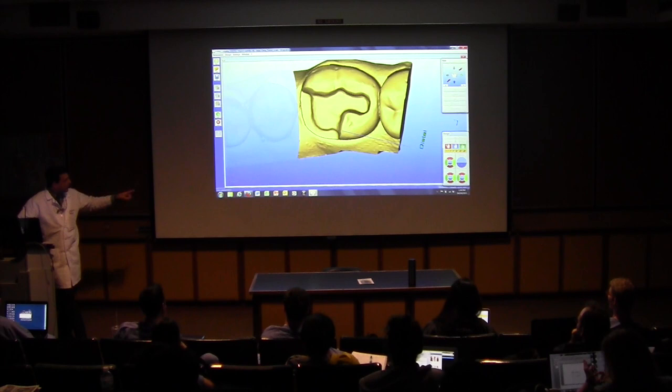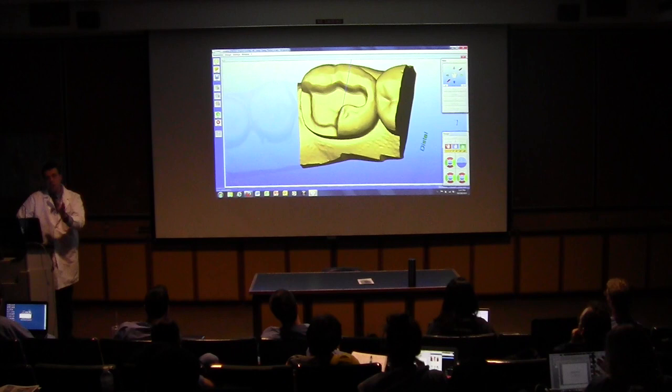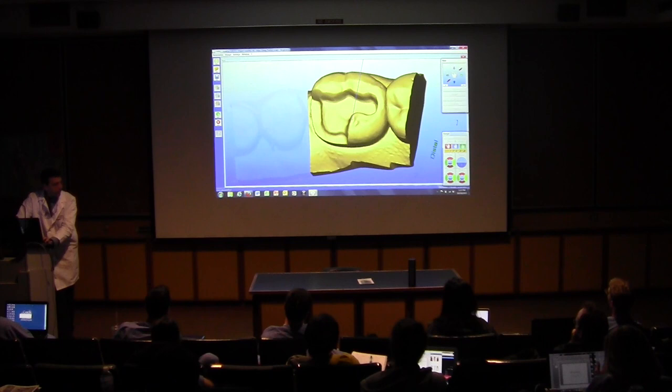All right, train the prep. So if you press and hold the left button and move your trackpad, you can move your preparation three-dimensionally. If you press and hold the right button, you can move over the screen, the way I'm doing right here. All right? Let me just go back one step here.